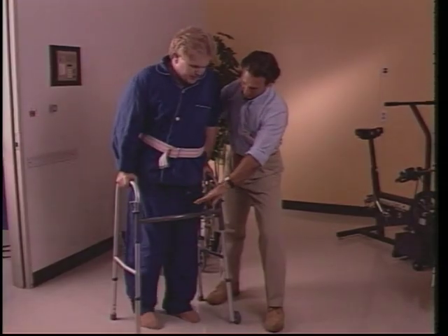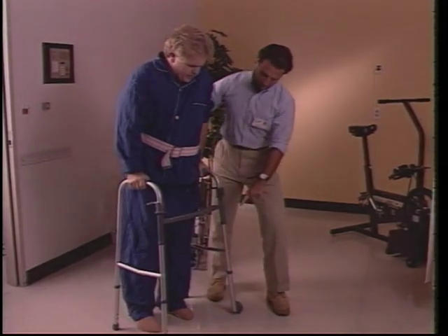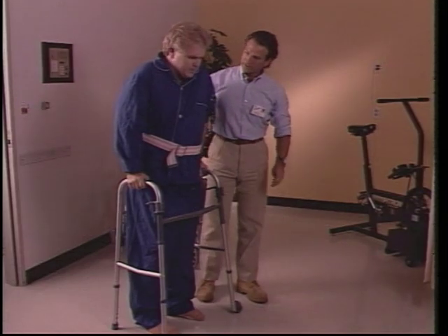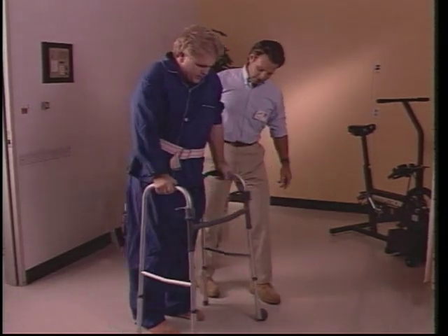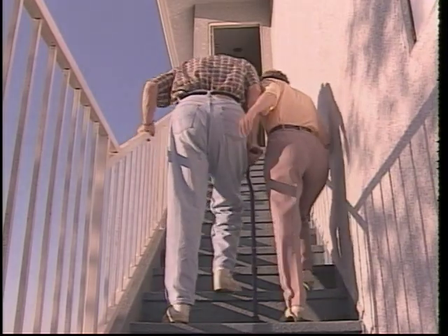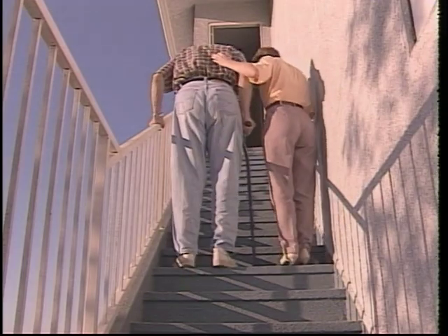The obstacles may be psychological as well. Patients who are ambulatory in one setting can become much less active in another. Learning to walk with a walk aid in a wide hospital rehab room is not the same as adjusting to your unique home environment. But with the appropriate mobility device and the proper instruction, many clients can find competence and safety in their familiar surroundings.